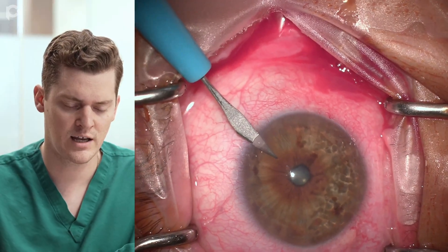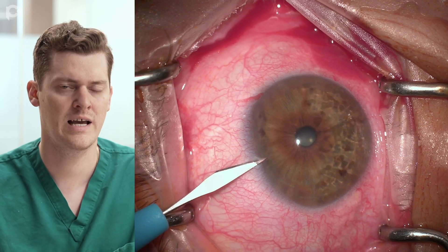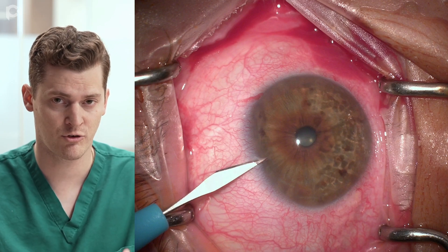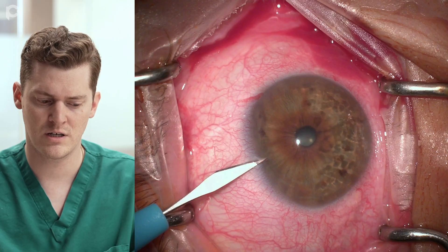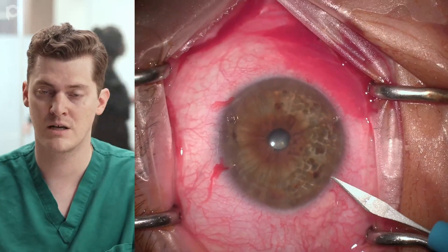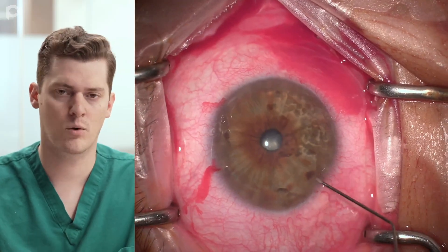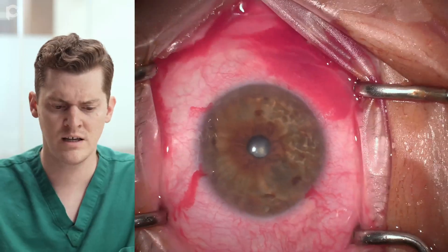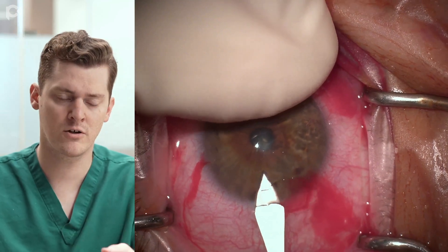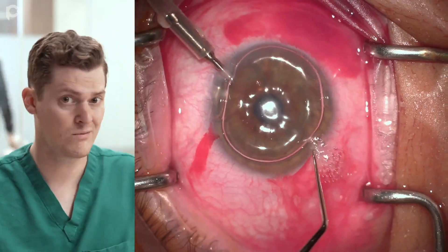First I'm making my incisions. When I was first getting started I was doing them a little bit haphazardly, but now I'm doing them very intentionally with a certain size in mind. That first paracentesis used supranasally for the AC maintainer I want to be a little bit shorter and not quite as wide as the incisions closer to where I'm using manipulation with the reverse Sinski hook later. That gives me a better seal so there's no bubbling or wound leak. After making those paracenteses, I put a little lidocaine in for further anesthesia, using my finger as a backstop instead of a second instrument.